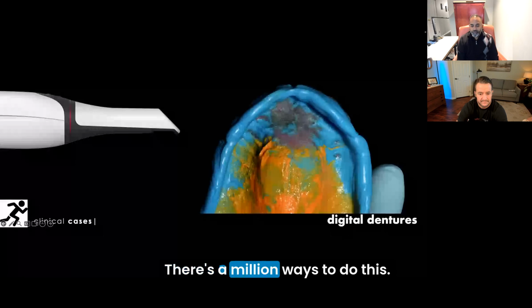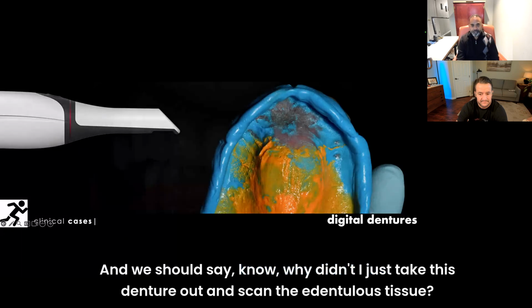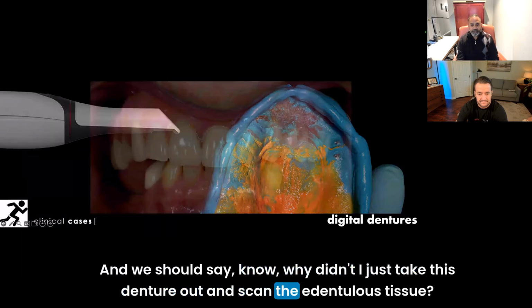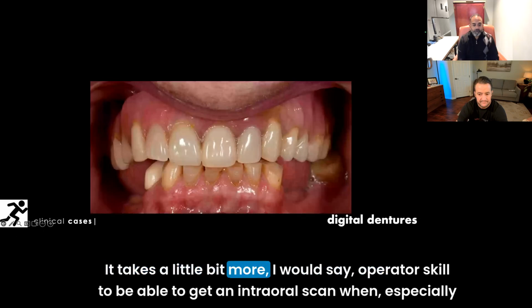There's a million ways to do this. You can do this whichever way that you're used to doing it. And we should say, why didn't I just take this denture out and scan the edentulous tissue? I absolutely could have done that. It takes a little bit more, I would say, operator skill to be able to get an intraoral scan, especially when it's edentulous.